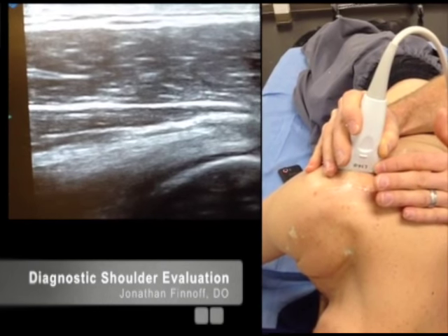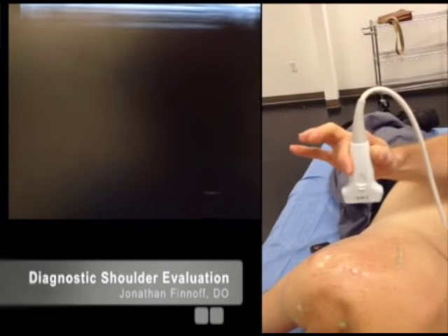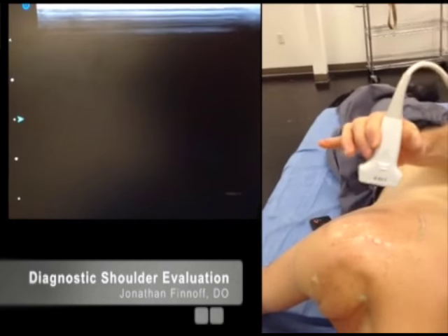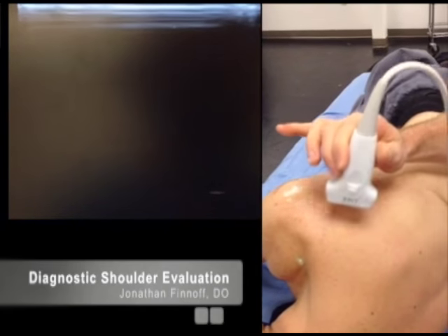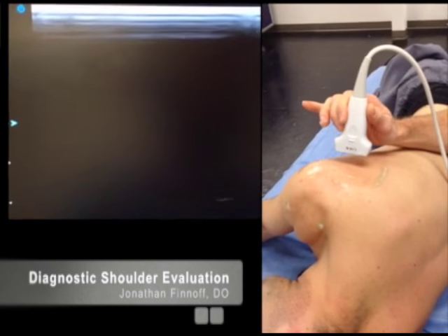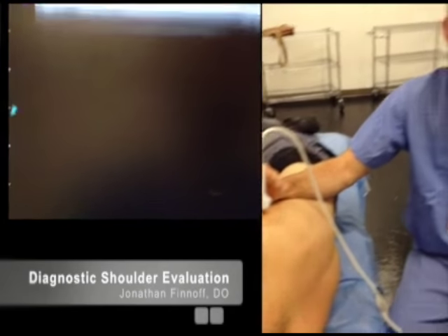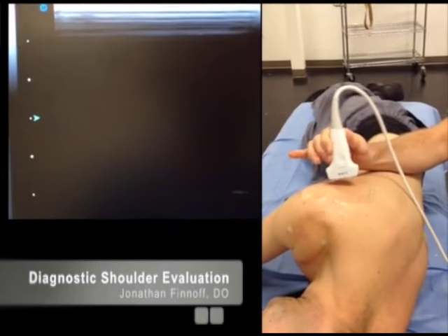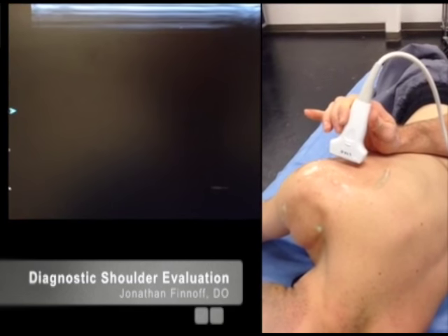A heel-toe maneuver is moving the transducer like this. Wagging is moving the transducer like this. When looking at specific structures, I'll glide to find them — moving the transducer either up and down or back and forth. Once I've found the structure, I'll eliminate anisotropy and optimize my image through small manipulations such as wagging or heel-toeing, to make sure the sound wave is perpendicular to the fibers of whatever I'm looking at.